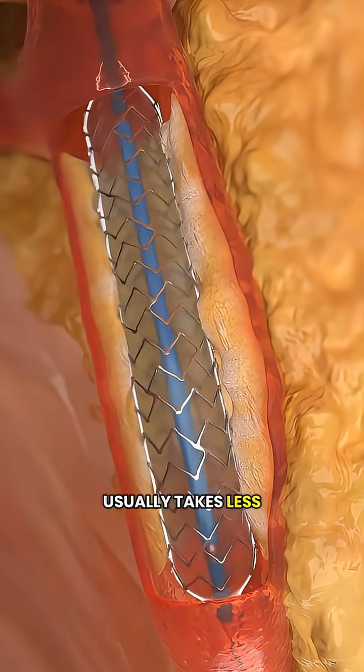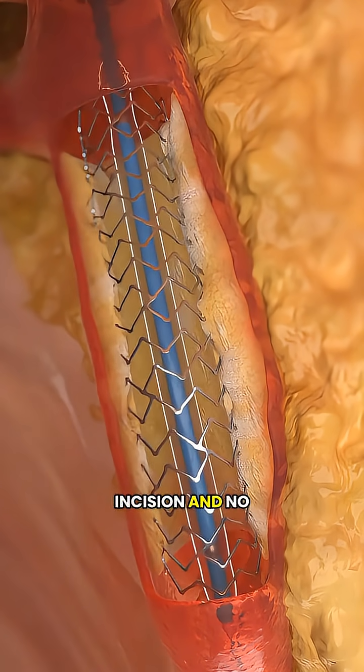The entire procedure usually takes less than an hour, requires no large incision and no stitches, making recovery much easier.